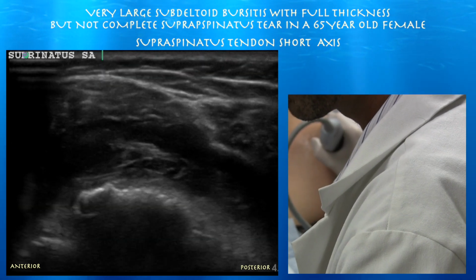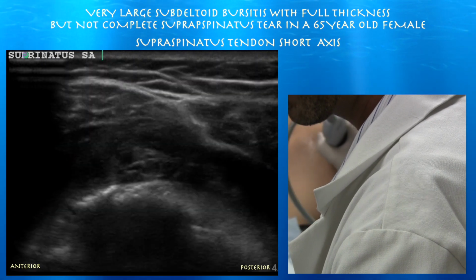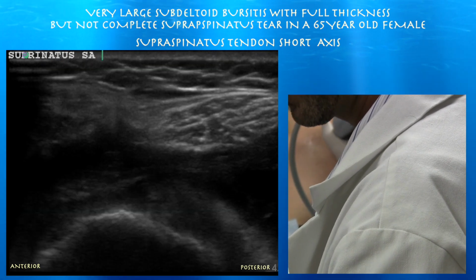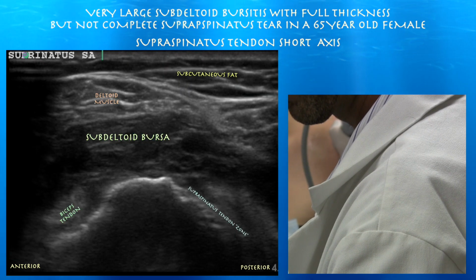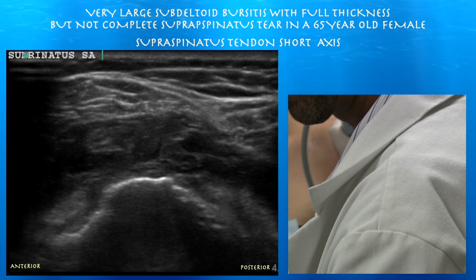Here we're going to look at the supraspinatus in short axis. Right side of the screen is posterior. We can see the biceps tendon and the sulcus. Now we're just trying to find the supraspinatus tendon. You really just don't see it. Again, in that zone where you would expect the supraspinatus, you just don't see it. So probably a full thickness but not complete tear of this tendon.